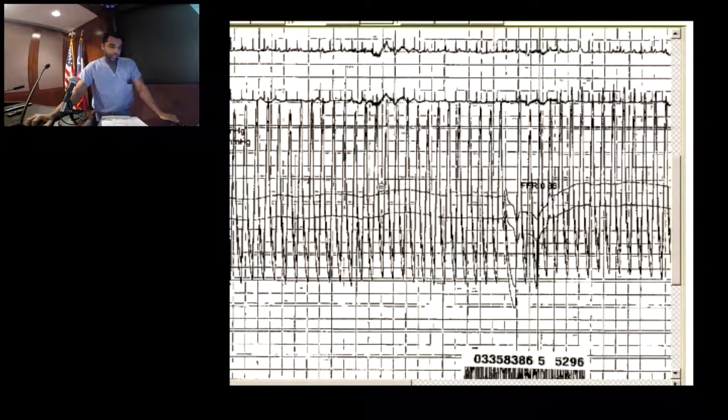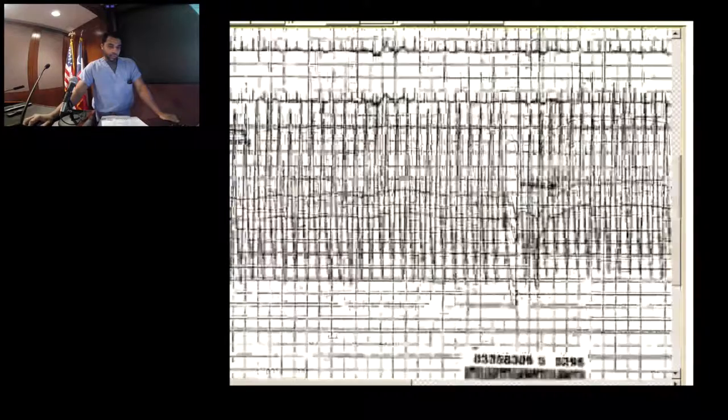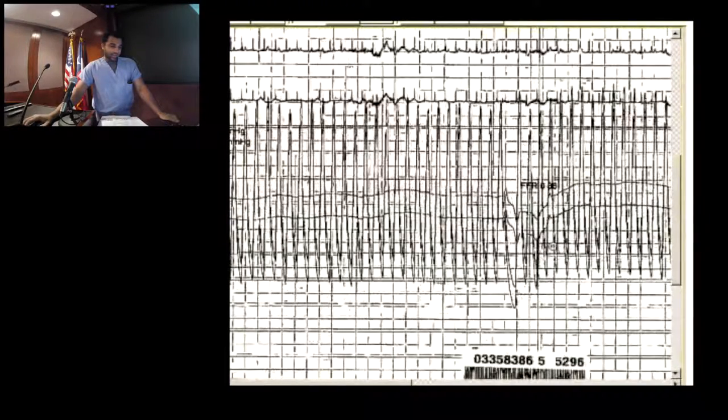It makes so much more sense when it's in color. Basically, you're reviewing the mean pressure across the stenosis compared to your aortic pressure, and some people use a cutoff. I think the original paper was 0.75. Some people use 0.8. Those are generally the two accepted values. If you have something below that, it's a hemodynamically significant stenosis, which you can revascularize.